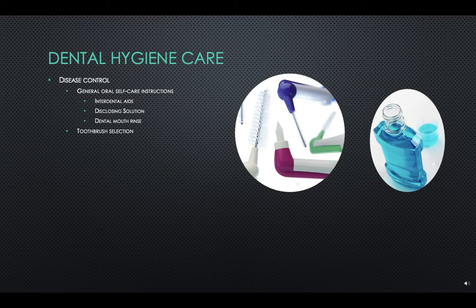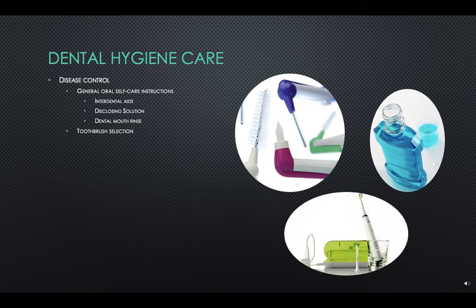Toothbrush selection. Power brush. Used with soft filaments, a light stroke, and at a low speed, powered brushes have been shown to be more effective for maintaining gingival health and cleaning around the appliances than manual toothbrushes. Manual brush. Soft brush. A soft brush with end-rounded filaments is recommended.